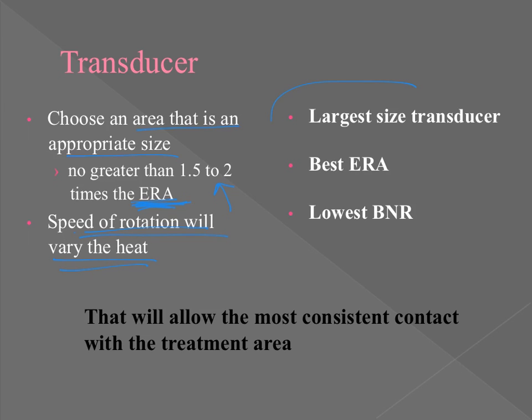So what's the ideal transducer head? Largest size transducer, best effective radiating area, and the ideal would be a low BNR, because this is going to create the most consistent treatment, and guess what? Allow for what? A larger treatment area to be treated.